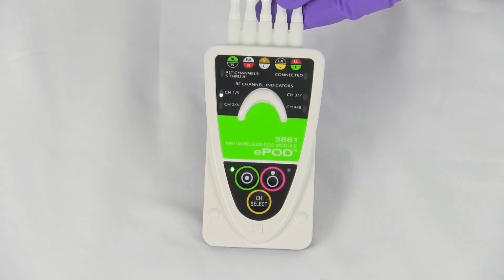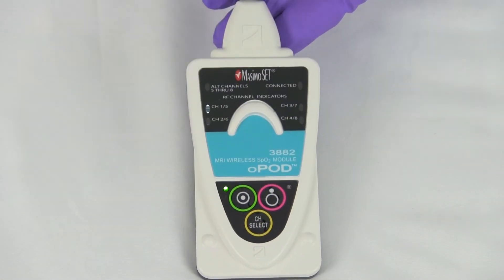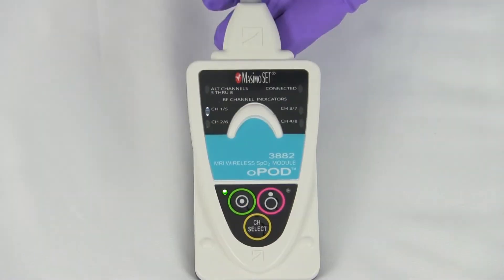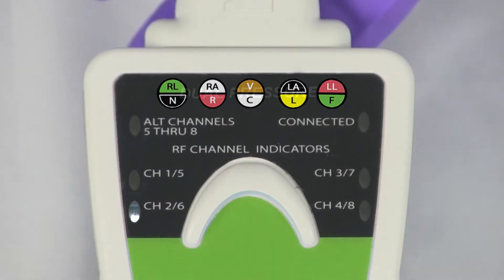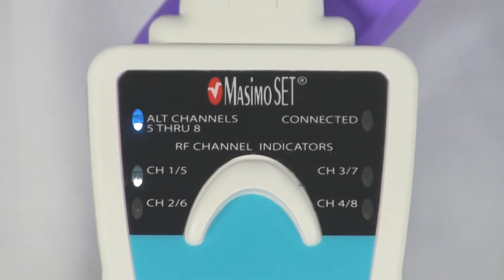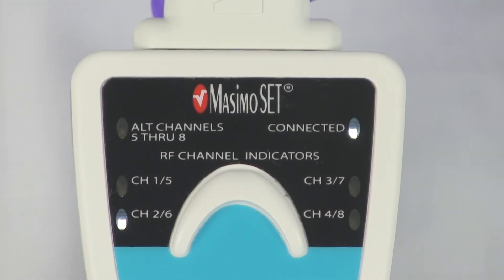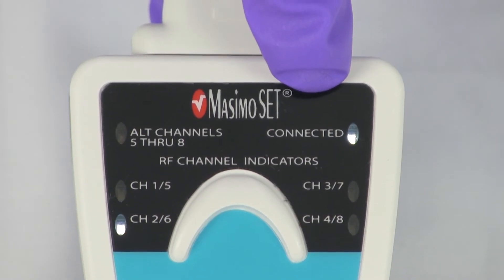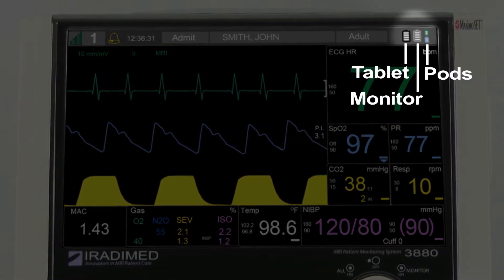Finally, to connect the pods, the user will gently press the channel select button. The first press will place the pod into channel select mode and the green light will begin to flash. The user will press the channel select button continuously until the desired channel is selected. Each of the four channel lights can represent both channels 1 through 4 and 5 through 8. The blue indicator light will illuminate at the top left corner of the pod for channels 5 through 8. Once the user has selected the appropriate channel to match the 3880 system, check the connection light on the pod and confirm the 3880 monitoring system has the associated pod battery icons on screen.